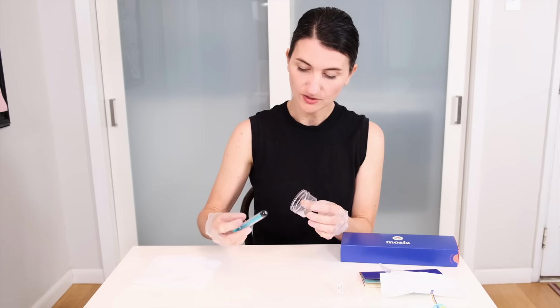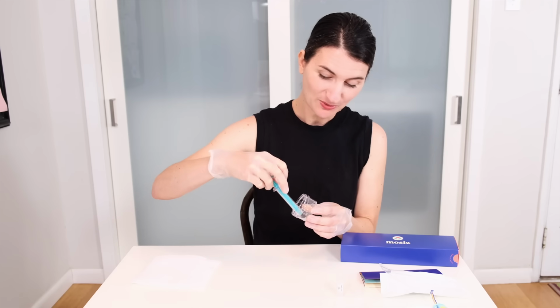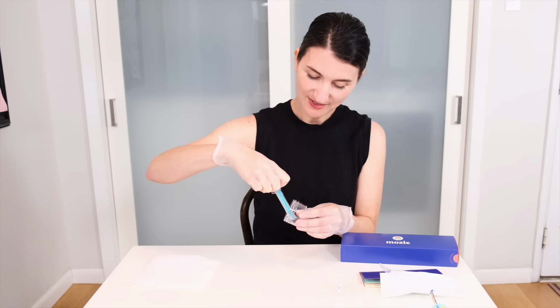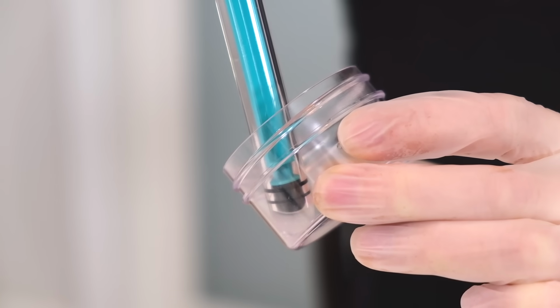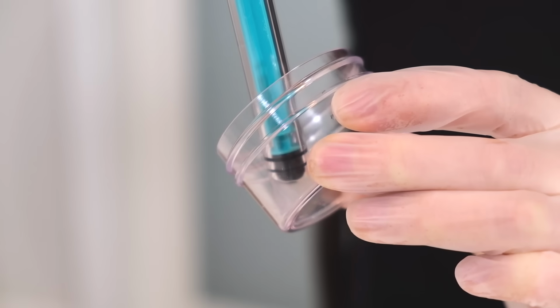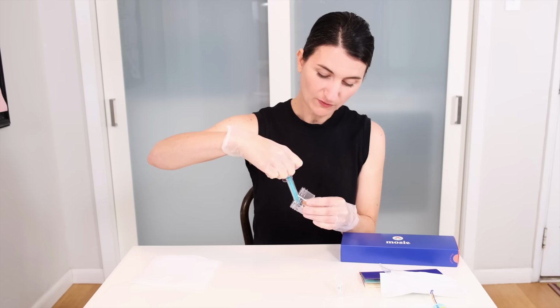So I'm going to take our syringe and I'll begin to suck it up. You may notice you might have that fresh sperm smell. So for people who have not worked with sperm before, don't be alarmed. It's very natural. So I'm going to begin. I put that slit opening in there. You dip it all the way in. Make sure it's immersed in there, and you are going to begin gently sucking up the sperm. I'm doing it very patiently so that we avoid getting any air bubbles. Now we're at the very end. There we go.